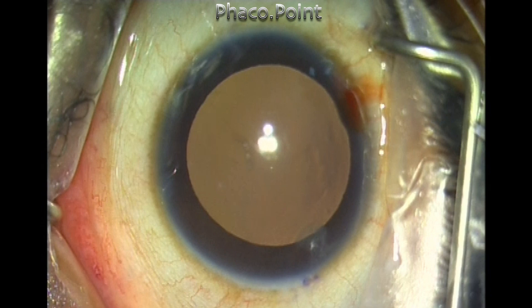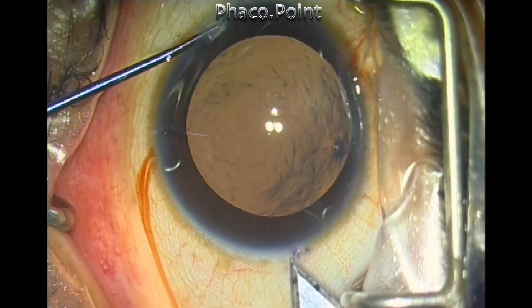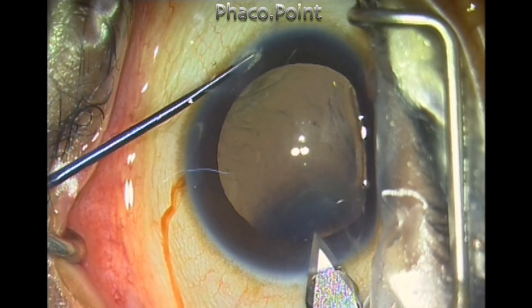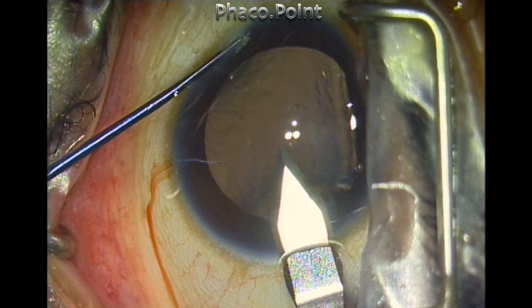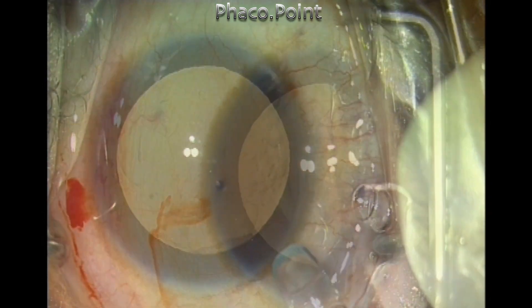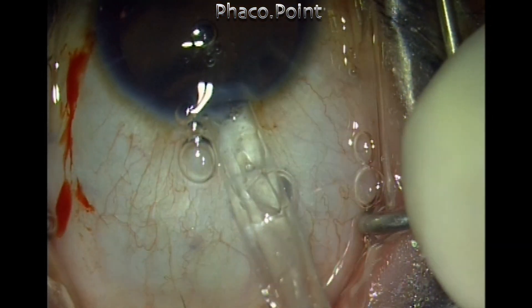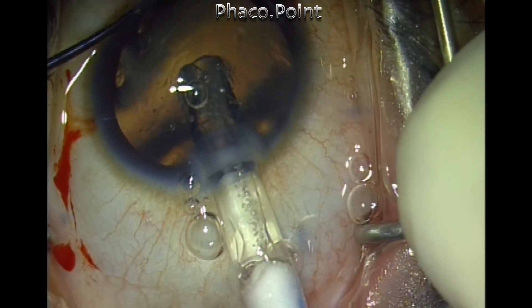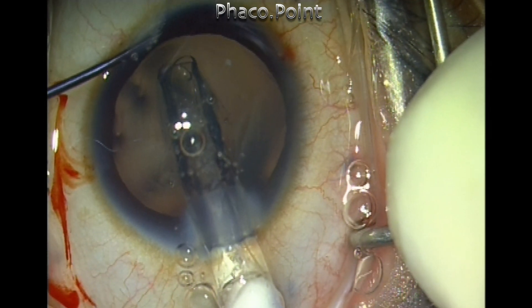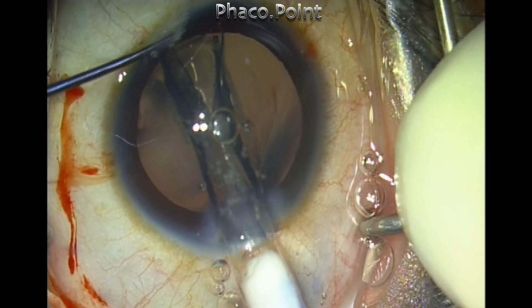Using this pocket incision, I'm able to create the side port through which a small amount of viscoelastic is injected, after which I use the other corneal pocket to create the temporal clear corneal incision for ICL implantation. The corneal pocket gives you a very gentle yet tangential hold on the eye — firm and good, enabling you to maneuver the eye into a coaxial position easily, without conjunctival tear or subconjunctival hemorrhages. I'm using the corneal pocket incision as traction to inject the ICL slowly, making sure the perforation appears toward the right so the ICL is in the correct orientation. Please try the corneal pocket incision — I'm sure it will work well and help you in tough cases. Thank you for your attention.